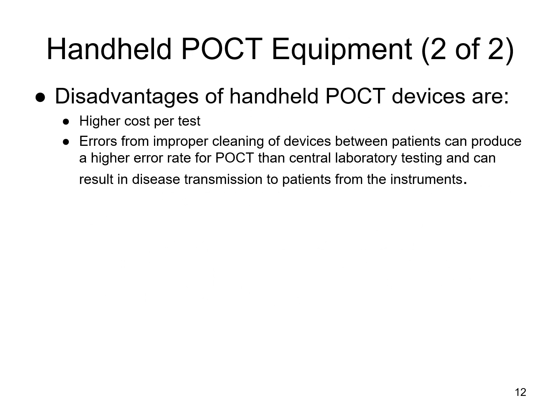Now, like I just previously mentioned, these cartridges and things for these analyzers can get pretty costly per test, so you don't want to waste anything. You want to be sure that you properly maintain that machine as far as the maintenance that's required on those machines. And because they are point of care type test machines, you can do this testing at bedside. So you want to use caution to make sure you don't have errors by doing things like reusing test cartridges.